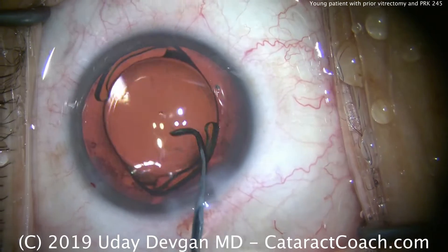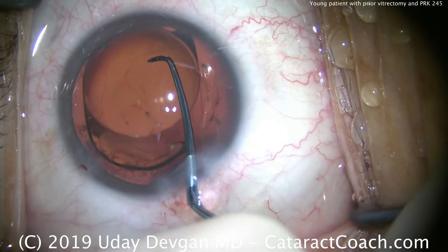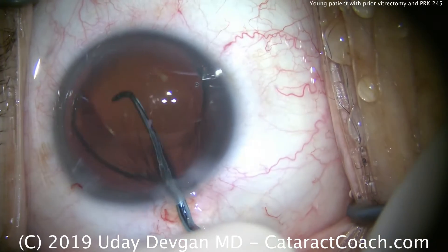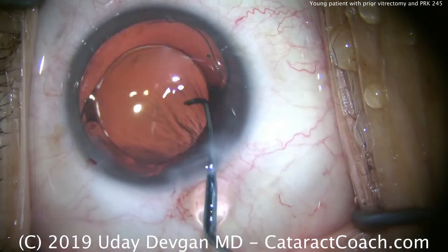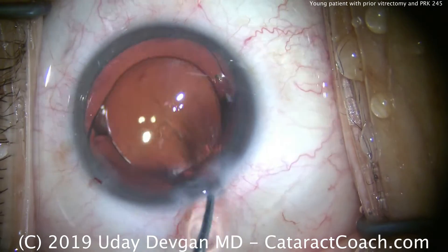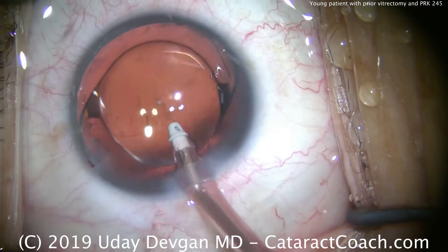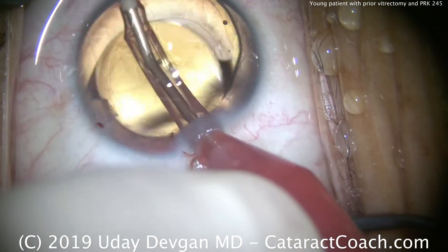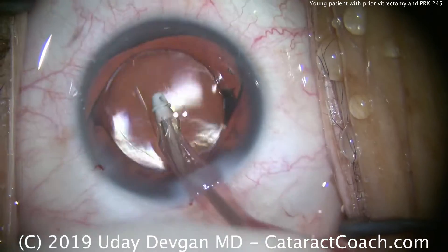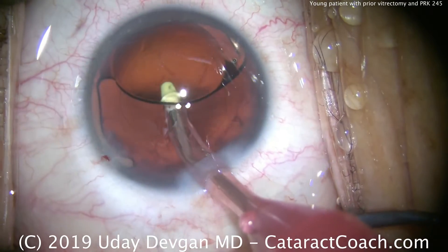In this case, we want a tinier incision — more in the 2.2 mm range instead of 2.7 or 2.8. Rotating the lens into position, you can see a beautiful overlap of the optic by the capsular rhexis. To finish up, we'll put the i/a probe in the eye. That's a reverse pupillary block, so we go and tent up the iris — lifting the iris will equilibrate pressure between the anterior and posterior chamber and bring it forward.